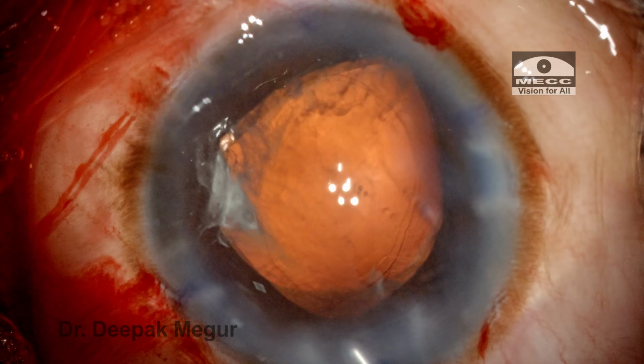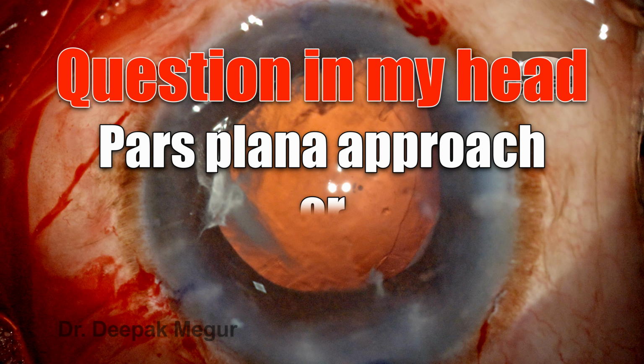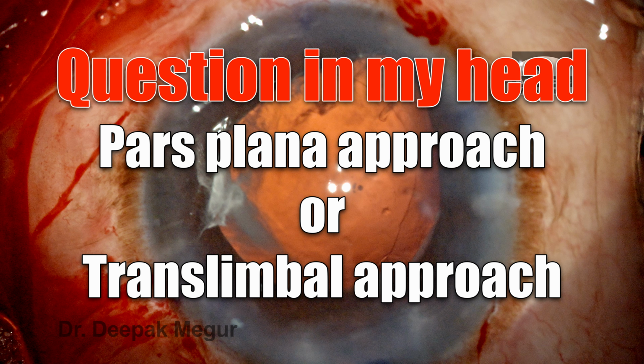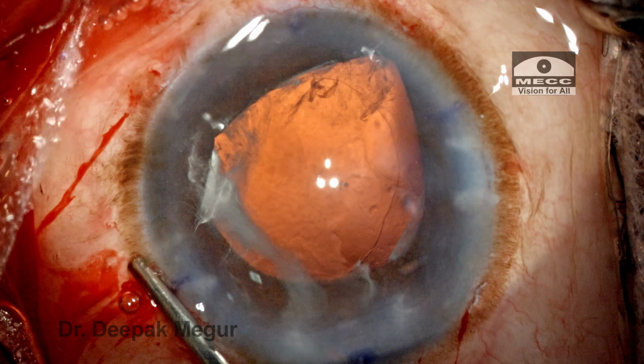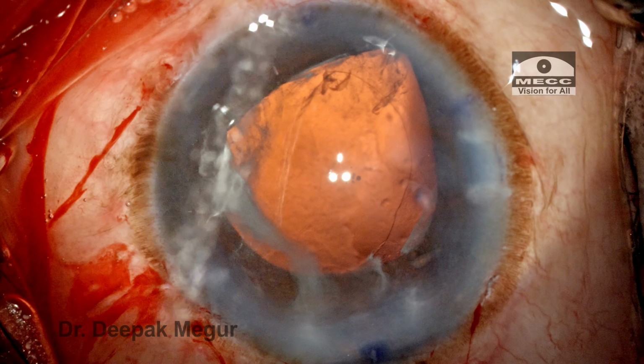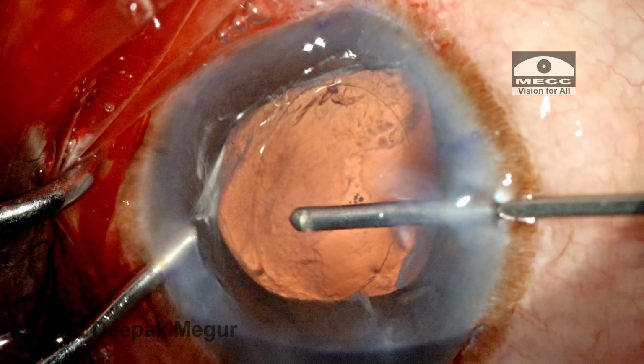At this stage, I need to answer a couple of questions in my head. What should be the plan of doing anterior vitrectomy, a pars plana approach or a translimbal approach? Now, because we know that the vitreous is prolapsing from behind and across the zonules and not through a posterior capsular tear, I would like to go ahead and try the pars plana approach. Although initially I thought, let me try the translimbal approach.